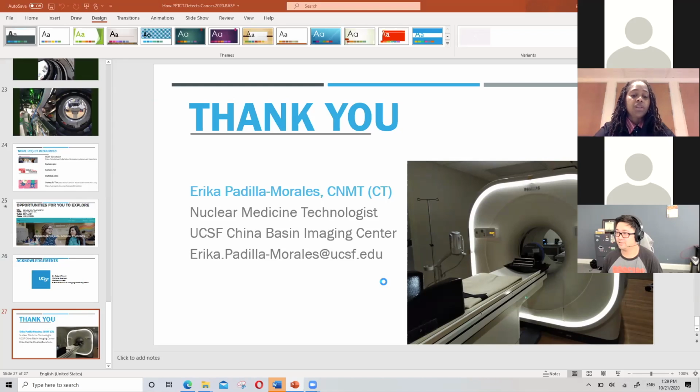Basically, we want to take a picture of where cancer is in the body, whether or not there are tumors involved, if those tumors are active, if they're shrinking. It depends, but these pictures monitor the progress of what's going on. And again, because PET is looking at how the body is metabolizing things, how active these cells are, it's important to know that radiologists are looking at all different components of these images.